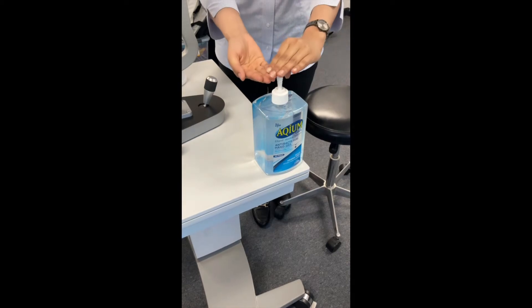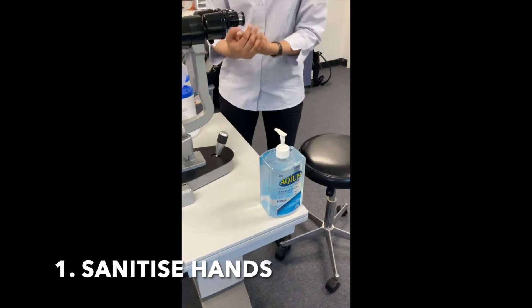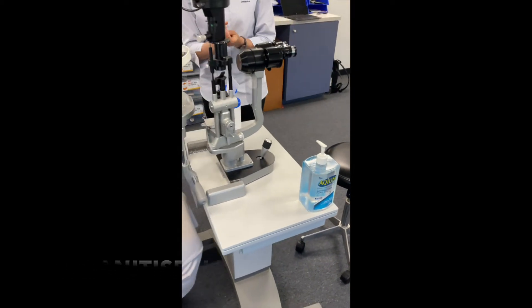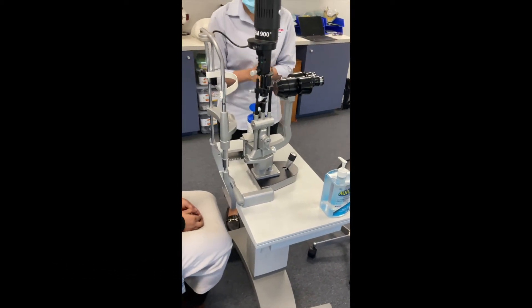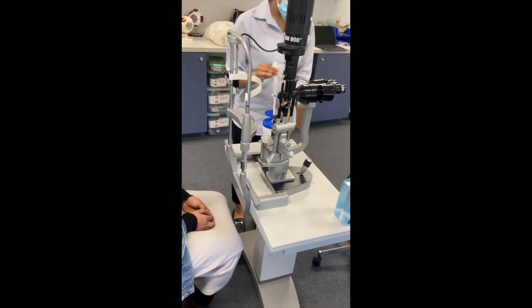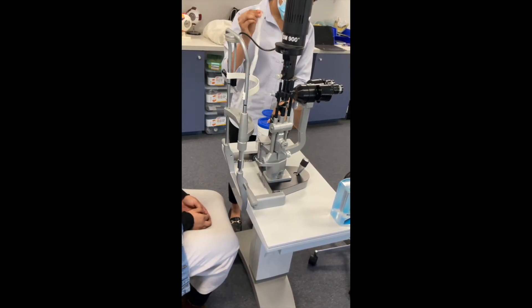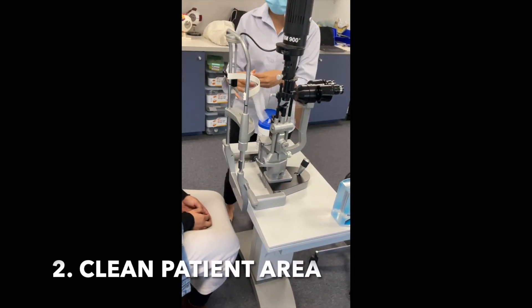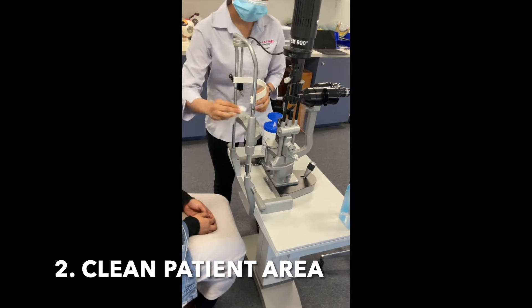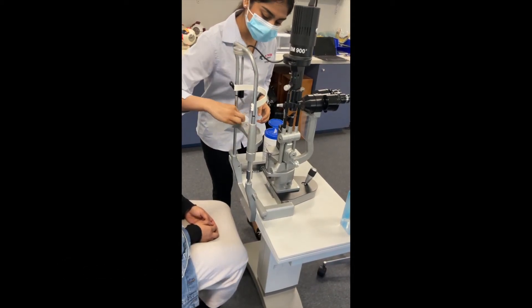Before we begin, it is important to clean our hands using hand sanitizer. Then we must clean the patient contact areas such as the slit lamp forehead rest and chin rest using alcohol swabs.